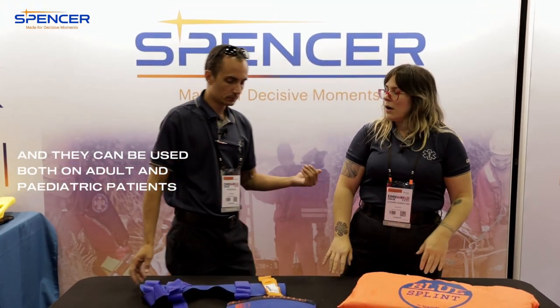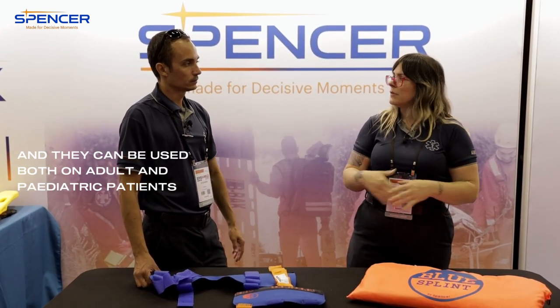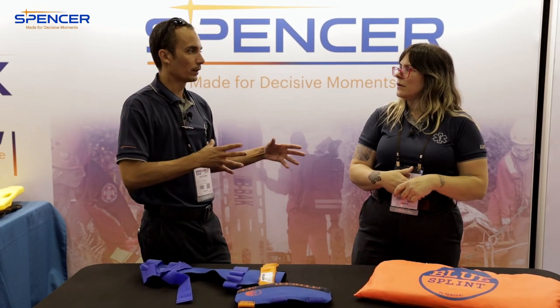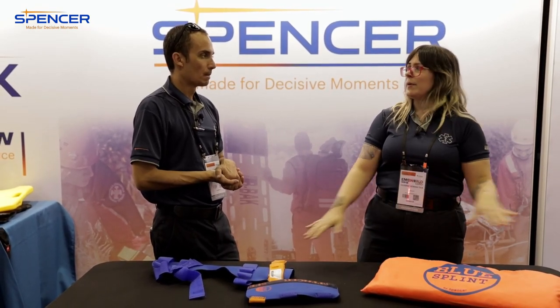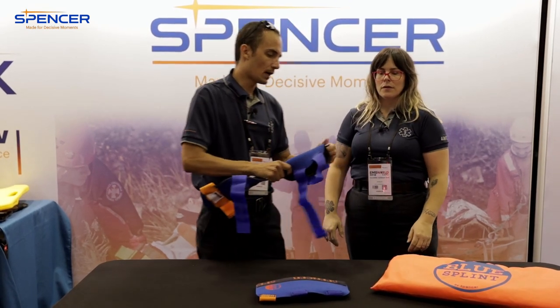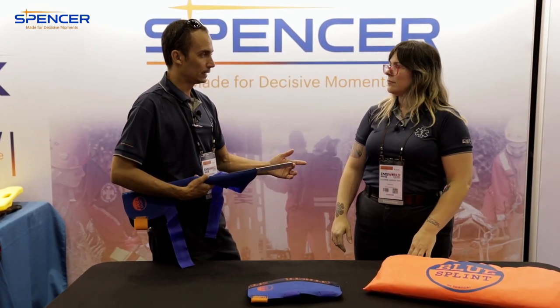What happens if you lose one? You can call your rep or call Spencer and they can send you just one replacement piece, which is super neat — you don't have to buy the whole kit again. And if you over-bend the aluminum insert from doing a lot of splinting, you can order just a new one of those.